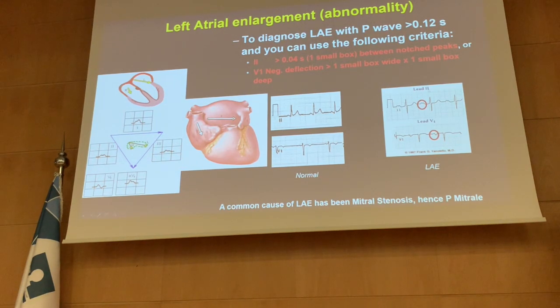So we are talking about atrial dilatation. If we have an abnormality in the atria, you're going to see it in the P wave. And we start with the first scenario, a patient with mitral stenosis. She is coming to the clinic because of progressive shortness of breath. And those cases, all the time, come to the clinic when they are pregnant. Why?